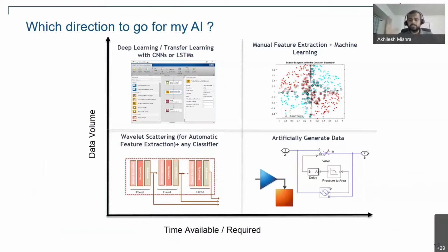So we have machine learning, deep learning, but I would like to point out, it depends on where you're at with the data and how much time you're ready to invest in training those models. So I'll give you an example. Let's say there is a lot of pathological image data which you have right now as of today, and you have sufficient time to develop algorithms, simpler but more robust algorithms. Then maybe this machine learning plus a feature extraction approach might be a good one for you.